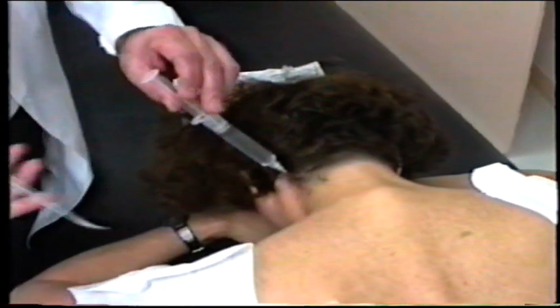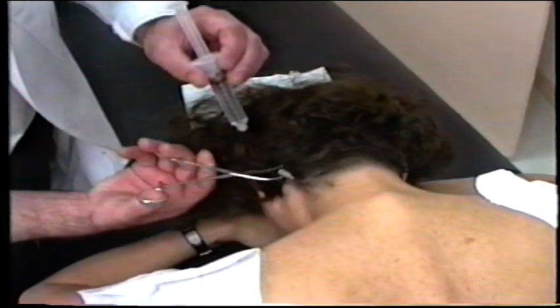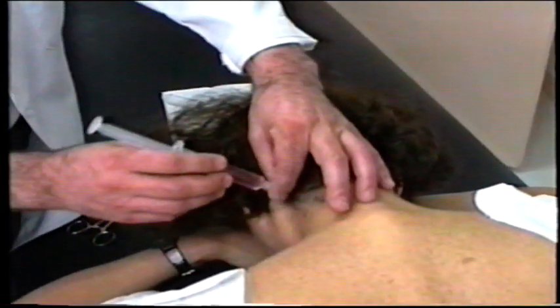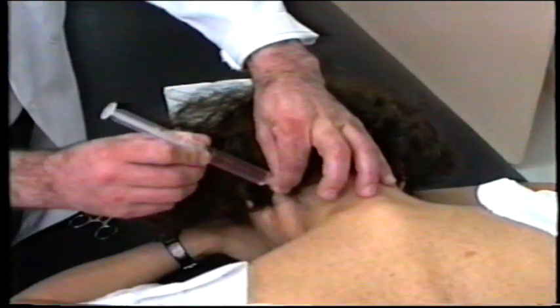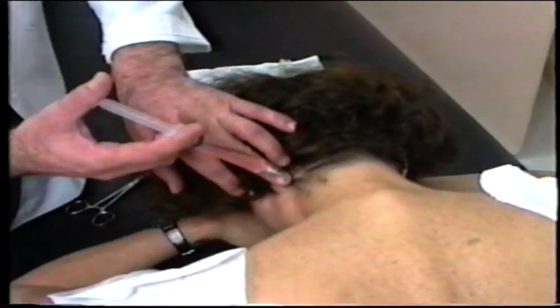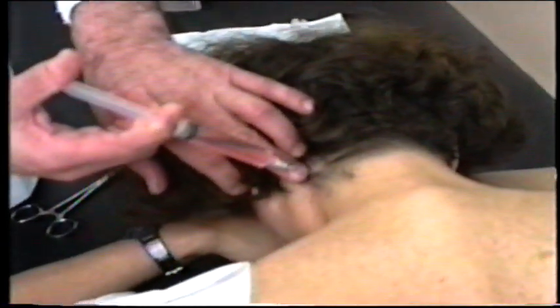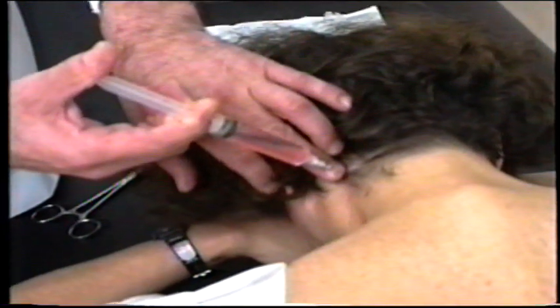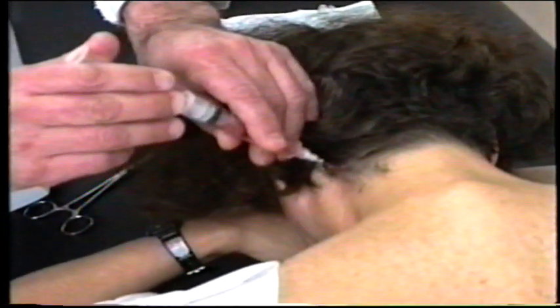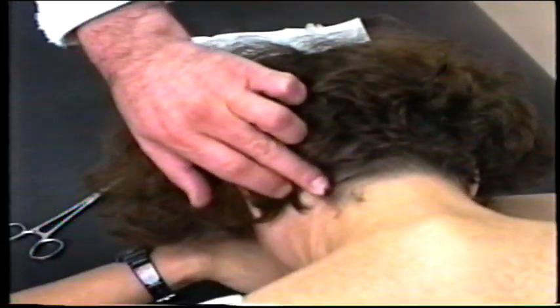At this point, you're disconnecting the syringe containing the local anesthetic, connecting the syringe with the combination of Marcaine and Hackett solution, and slowly inject approximately 1 cc of that solution into the area. Don't forget to withdraw after injection and remove the needle fast.